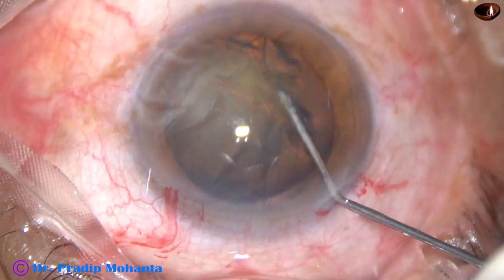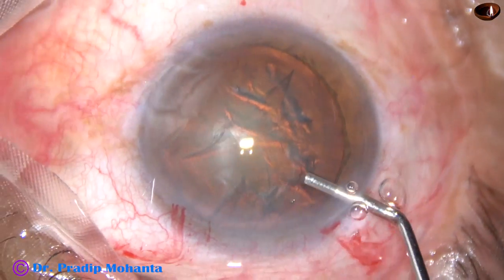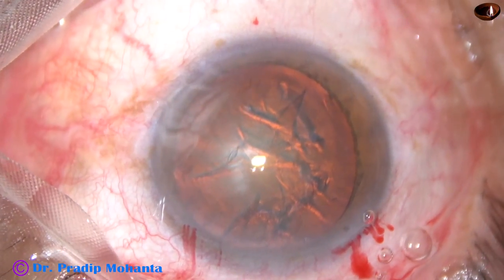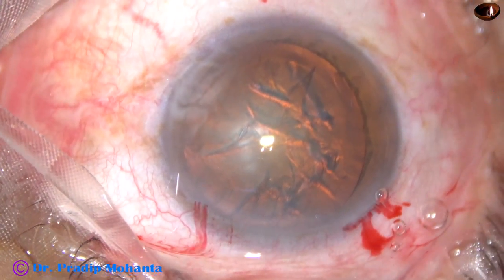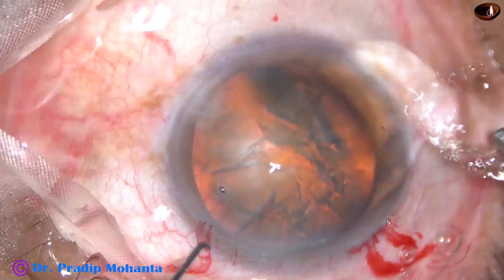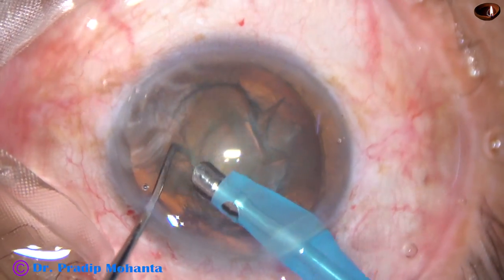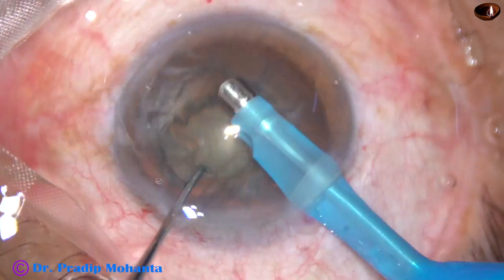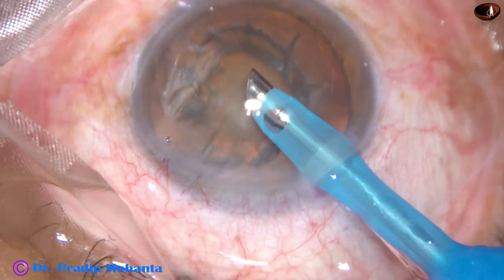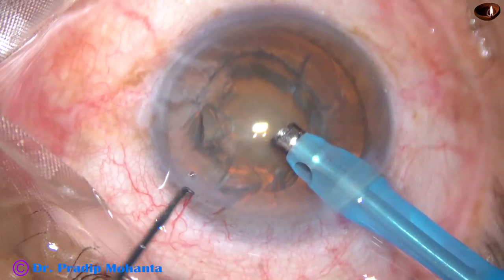The nucleus is depressed and rotated. Visco is again injected into the anterior chamber — this is 2% hydroxypropylmethylcellulose. And now the tip of the phaco needle is introduced into the anterior chamber. It goes bevel down. Some superficial cortical lens matter is removed. Then, with the help of the left hand, the handpiece is rotated.